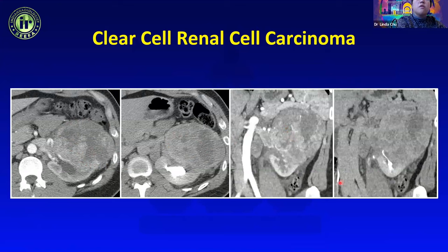The algorithm for renal masses containing fat: first look for internal calcifications — if present, suspect RCC; if not, suspect AML. For AML, assess whether it is solitary or multiple and note the size. Small AMLs don't require further workup, but AMLs four centimeters or more need referral for management due to bleeding risk. A classic AML with fat and soft tissue attenuation presents no real diagnostic challenge, but beyond four centimeters these patients are at high risk of bleeding and should be referred for embolization.